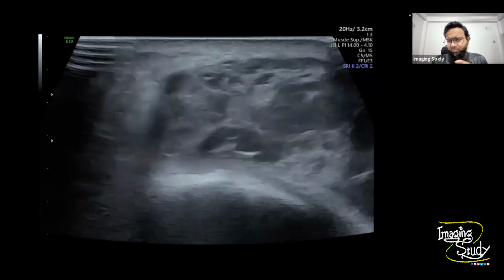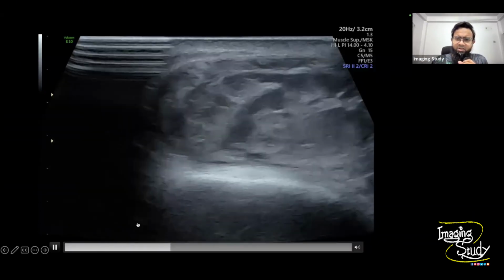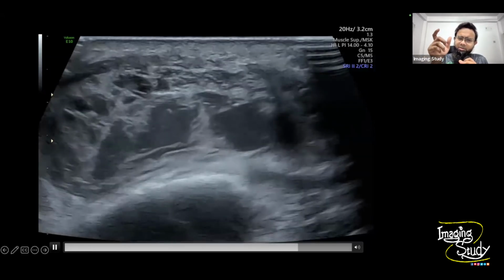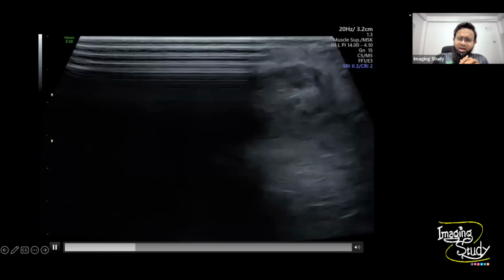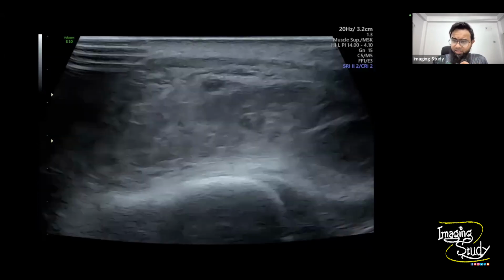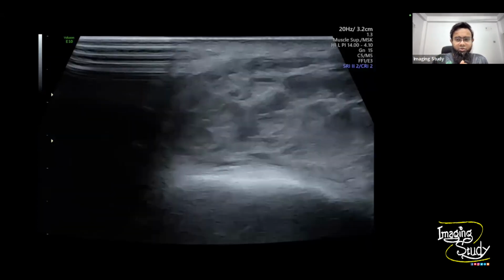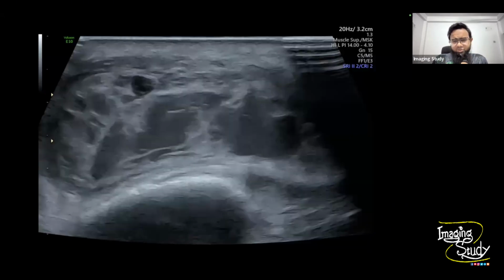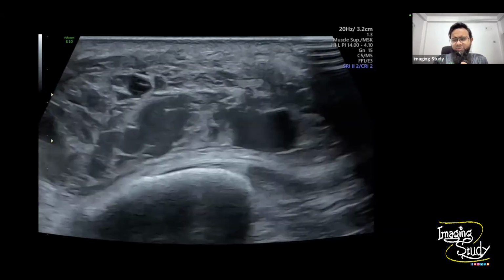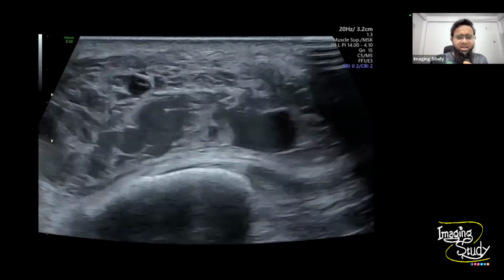That's good. Let's see that part again and again. I'm moving the transducer. If it was a 6-year-old boy or a 6-year-old girl, I wouldn't make the same diagnosis of an inflammatory state. I should think about some other differentials. This looks like an inflammatory condition or some multi-septate collection, but I'm not very satisfied with that diagnosis for this case also.